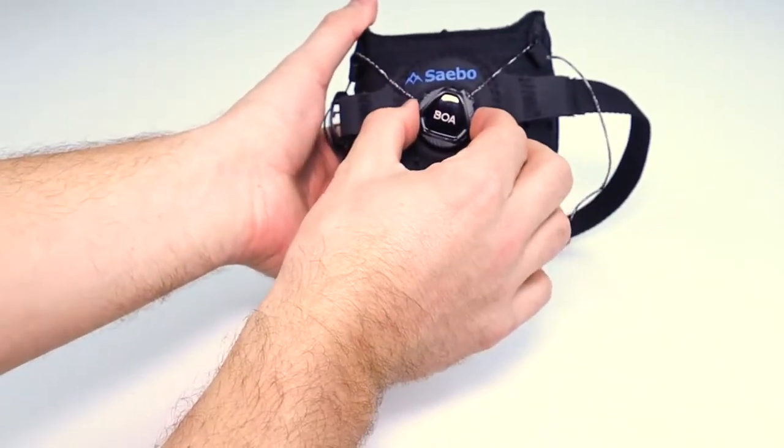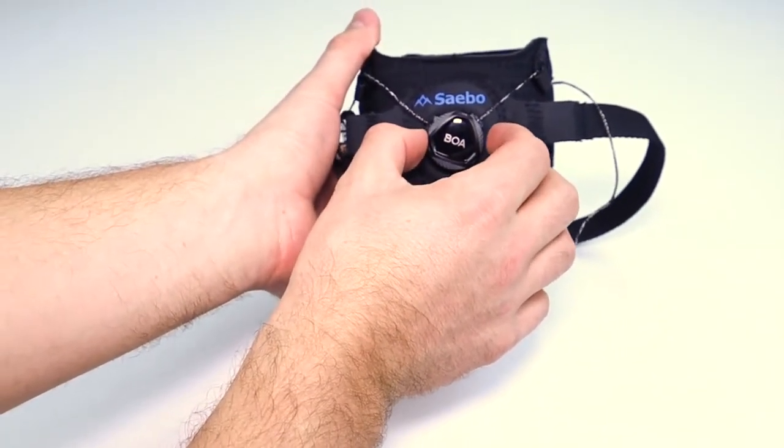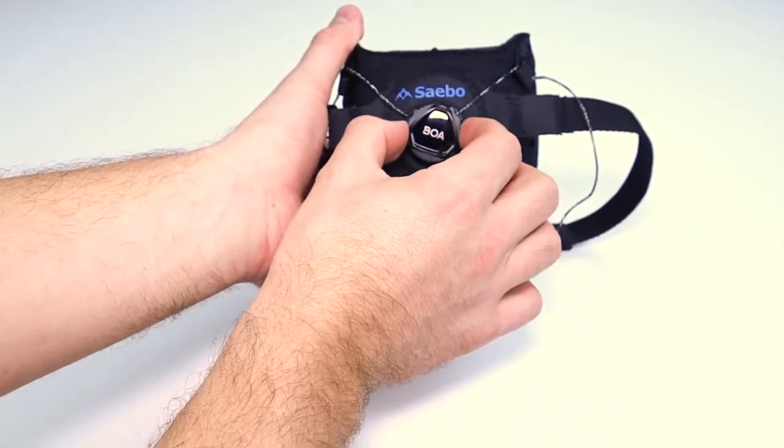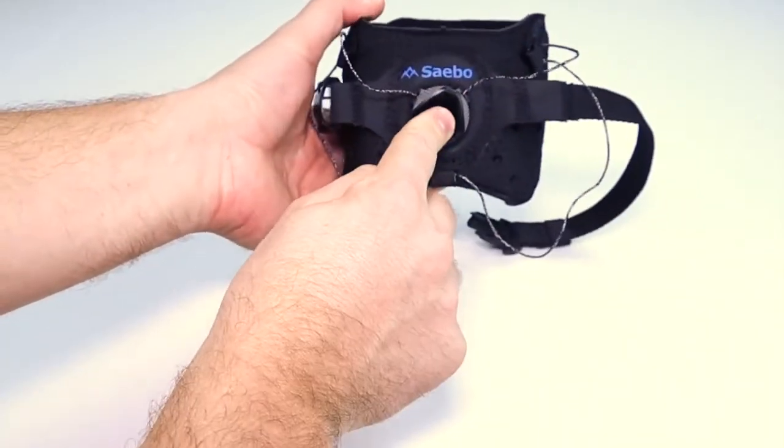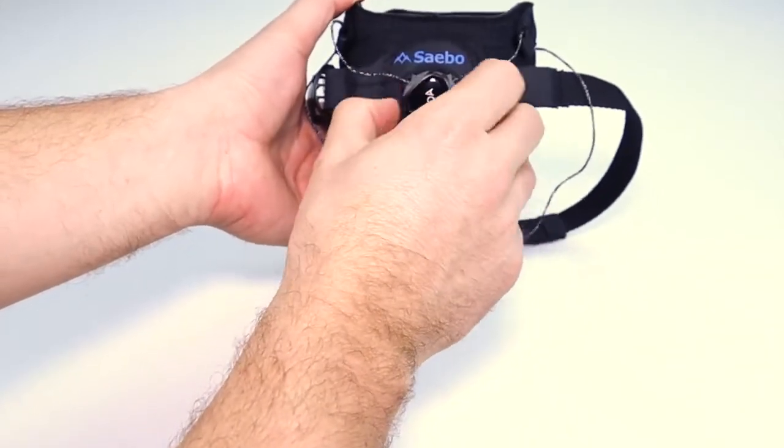Here you have the BOA dial. The BOA dial is meant for adjusting tension when you're using the Sabo Step. Pull it out and pull out the lace, push it in, and tighten the lace.